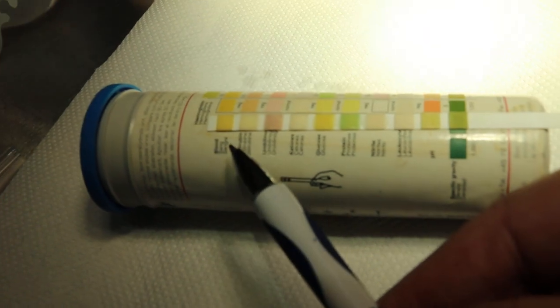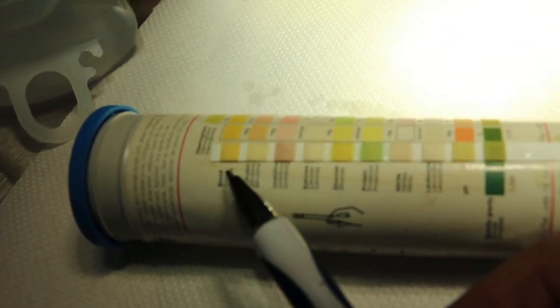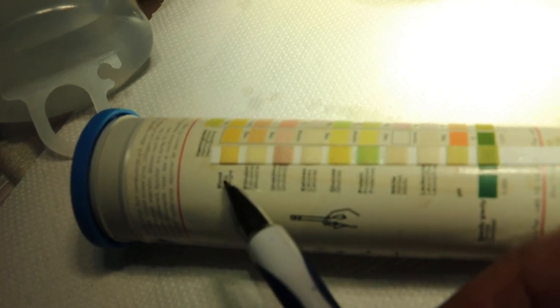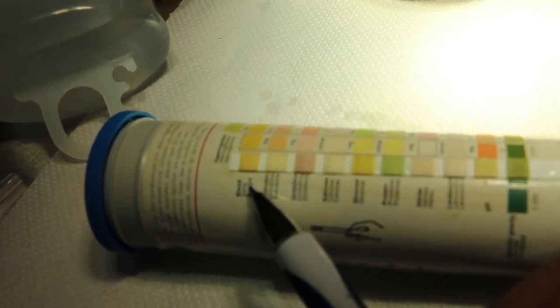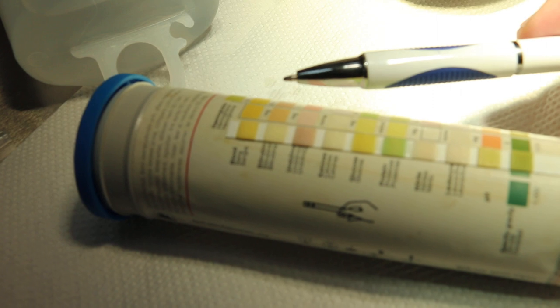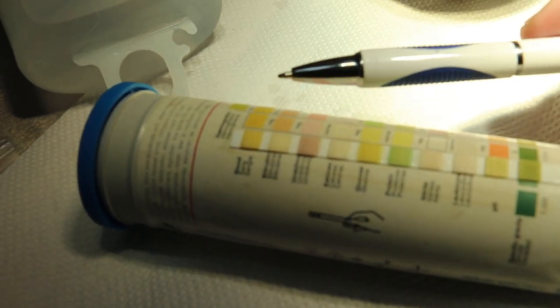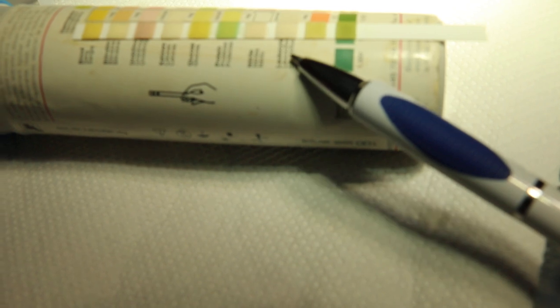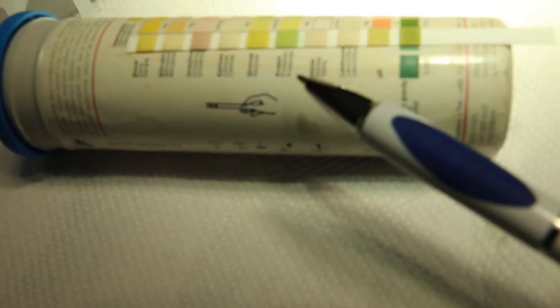There is no blood, because it's not green. It's yellow. Now let me see, yellow, maybe there's some little, not a lot of blood. Definitely no hemoglobin. And leukocytes also clear. Now the cat has a fever though. So that is the thing.